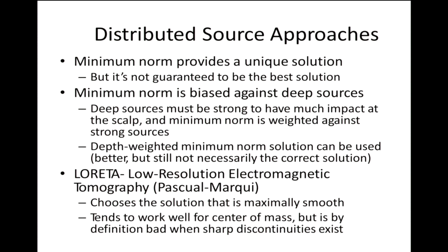Because what it primarily does is, from the output of the 64 channels, you get a matrix of, I think in LORETA these days, 6,000 voxels, and each voxel has an intensity, and each voxel primarily is a dipole. That's what it models. So you are literally decomposing your EEG signal, which is recorded from the scalp, into 6,000 small dipoles, and each of the 6,000 has x, y and z coordinates, which tell you where exactly in the brain this voxel is located.